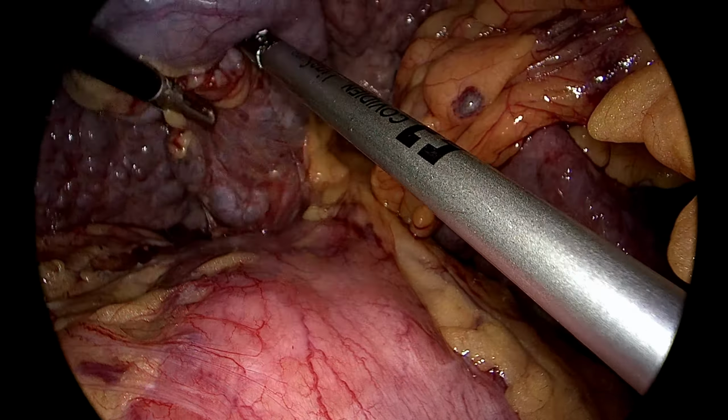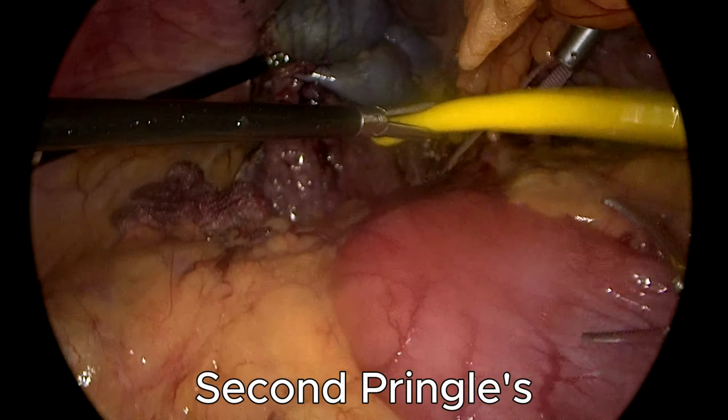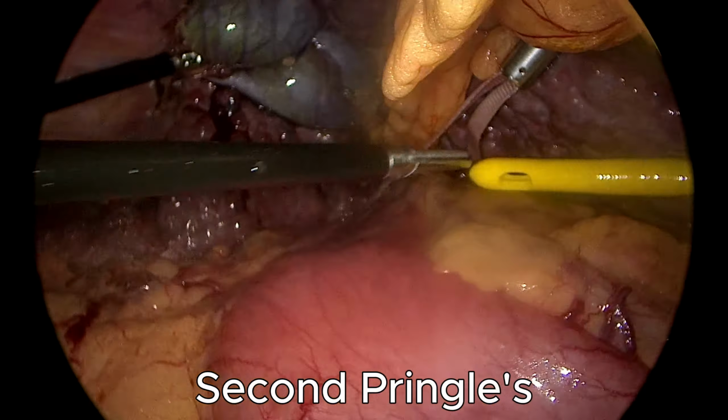To control inflow bleeding during parenchymal transection, we apply the Goldfinger device across the hepatoduodenal ligament, performing a vascular inflow occlusion known as Pringle's maneuver. A nylon tape is passed through it and held in port of control. In case the first Pringle fails or needs replacement, a backup Pringle maneuver can be performed by placing a Foley catheter around the hepatoduodenal ligament. This allows temporary occlusion of the portal triad when needed.